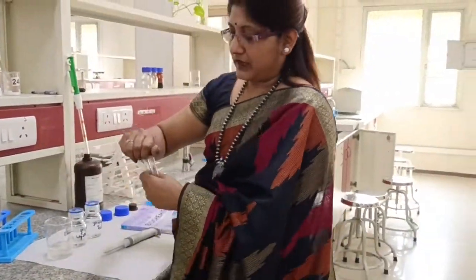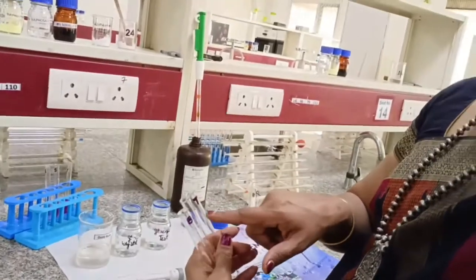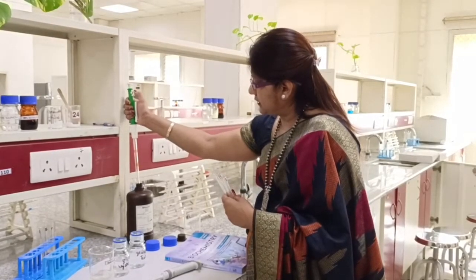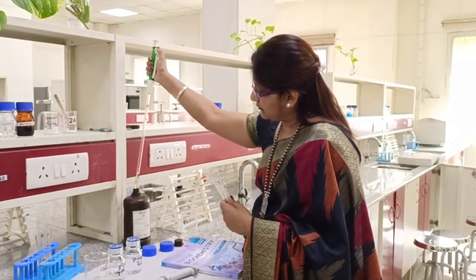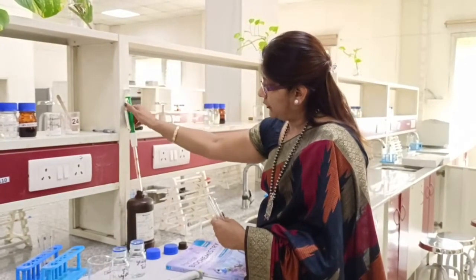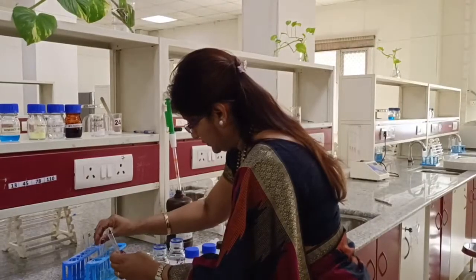We take three test tubes and mark them as blank, standard, and test. You can see the marking here. In each of these three tubes, we have to take 2 ml of the glucose oxidase reagent and pour it into individual tubes. We have to be careful in measuring the amount of reagent. I have already poured 2 ml of glucose oxidase peroxidase reagent in each. We then place these tubes in the test tube water bath.